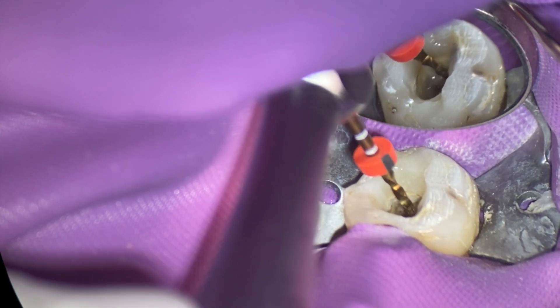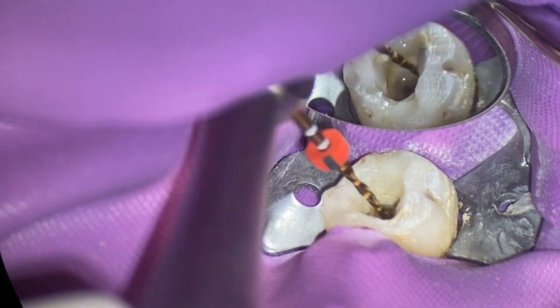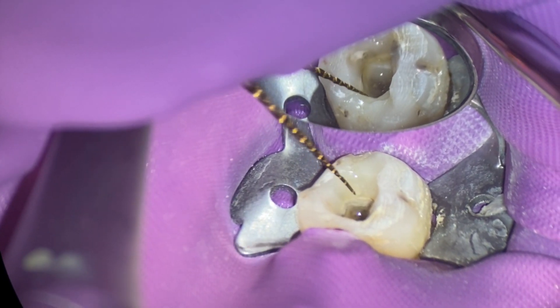This is All Things Dentistry, the place where we're passionate about sharing those unwritten hints and tips of dentistry. This is going to be a really short one — it happened this morning — and we had unwinding of the flutes.